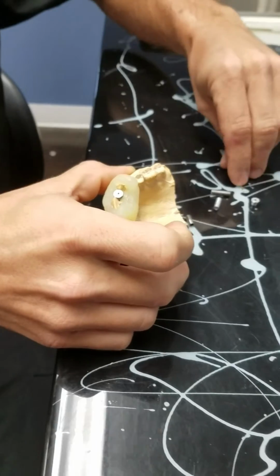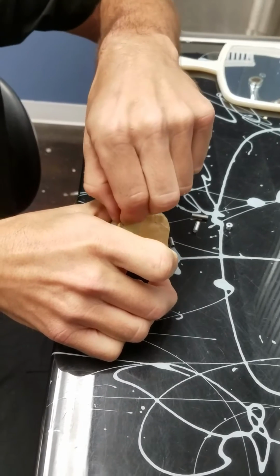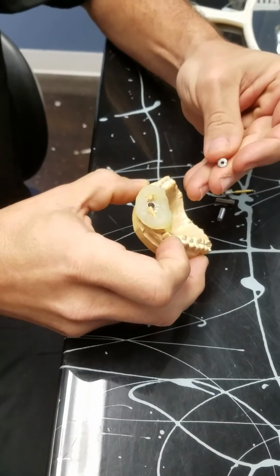Then you're going to drill the pilot hole. Once you're done with that, if you need a larger hole for a larger implant, you would use the larger pilot guide.